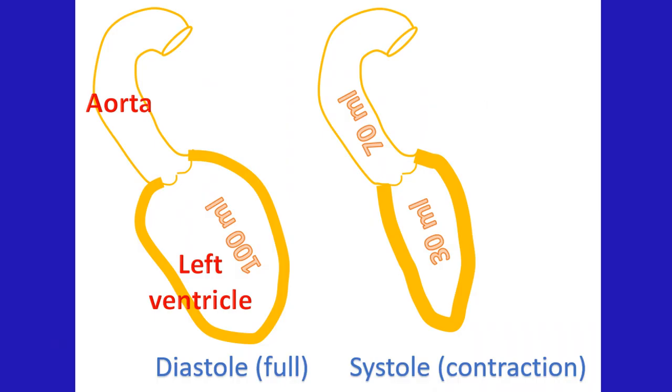While coming to function of the heart, the concentration is often on the left ventricle, which pumps blood to the whole body. An important value in the report is the ejection fraction. Ejection fraction is the fraction of the blood from the full left ventricle which is ejected out during each contraction.